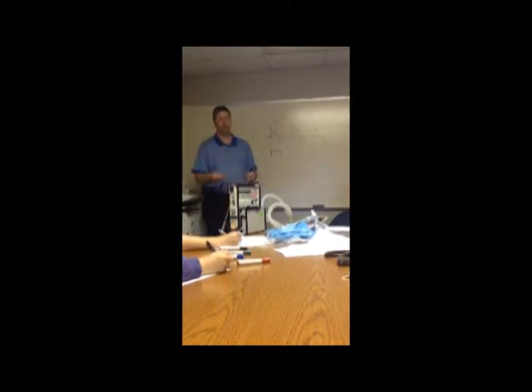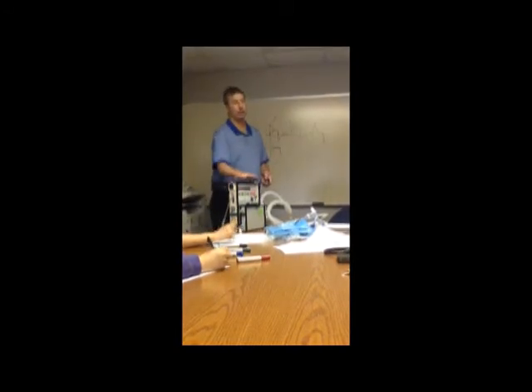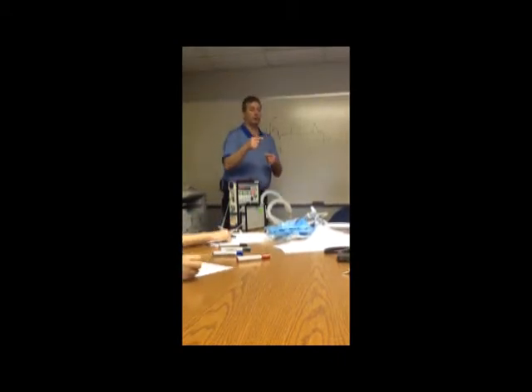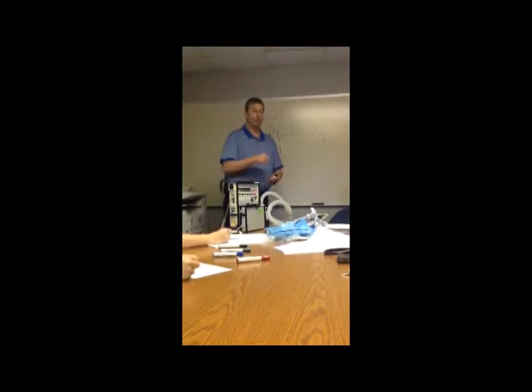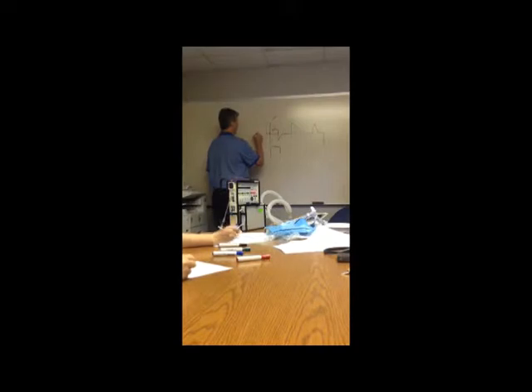And what we use to match and to know where to go, we'll talk a little bit more about, but the most important thing for us is the minute ventilation that was happening on the ventilator when the blood gas was drawn. So if you get a blood gas from a hospital, make note of some of the basic settings, of course, but the important number to know is the minute ventilation. It's usually either MV or a V with a dot on it on your blood gas slip. And it's usually 8 liters a minute, 10 liters a minute. It's that kind of number.